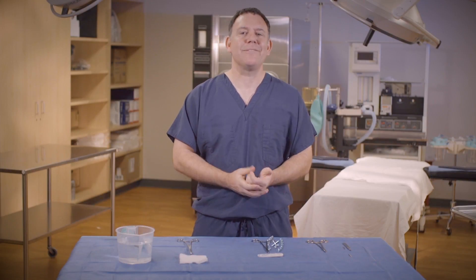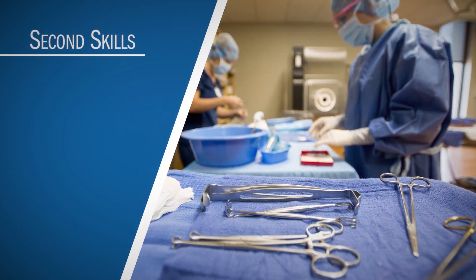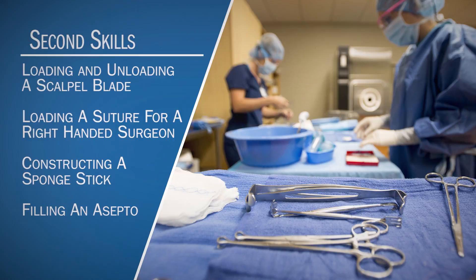Hello, I am Mike from Surge Tech Academy and today I'm going to demonstrate a few skills I call second skills, or accessory skills. The reason I call them second skills is because they only take a second to complete. Today I'm going to cover loading and unloading a scalpel blade, loading a suture for a right-handed surgeon, constructing a sponge stick, and filling an Asepto.